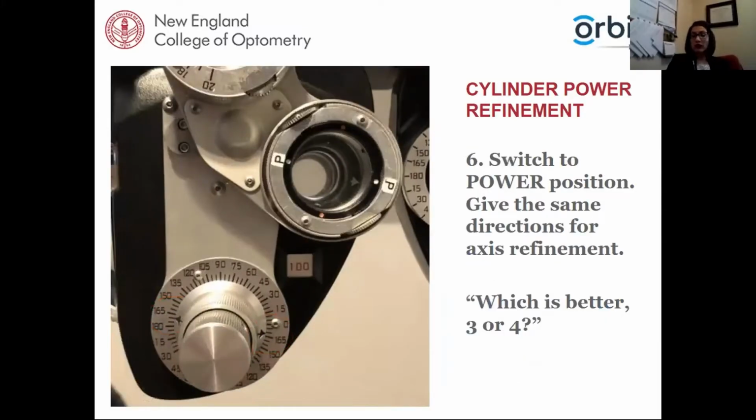Now we're ready to refine the cylinder power. So we want to switch the JCC to power position. And you could re-give the same directions, but very often your patient won't notice the difference between axis and power refinement. So I just continue to give the same directions.